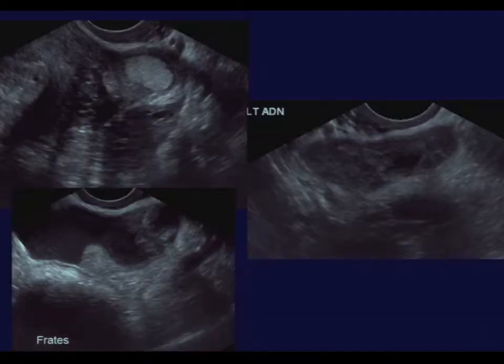Another patient with an unusual mass in the left adnexa this time. Here's the normal left ovary. Here's the uterus here. And here's this somewhat unusual looking mass. Very sharp margins between this echogenic center and the hypoechoic rim.